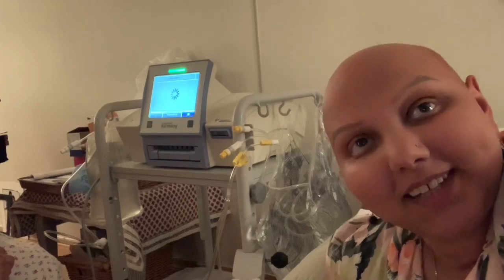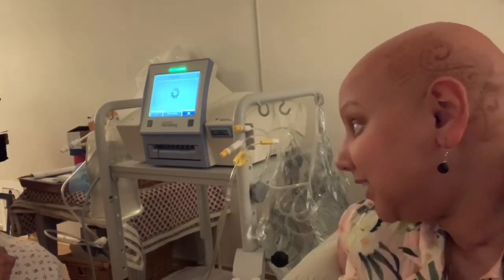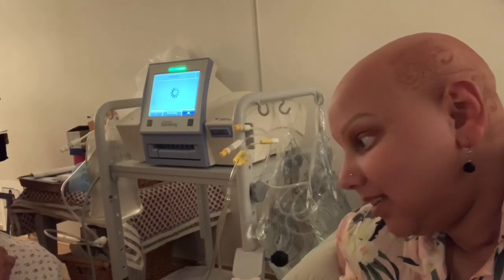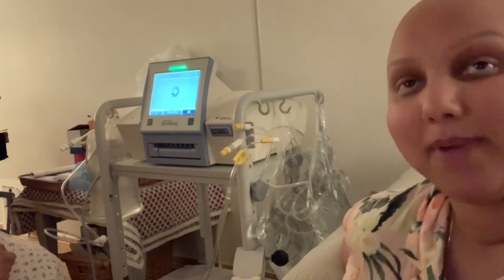As promised, I'm going to make a more detailed video about this automatic dialysis, which is not the same as what we did before — that was the manual one.